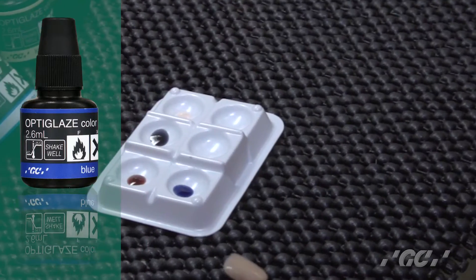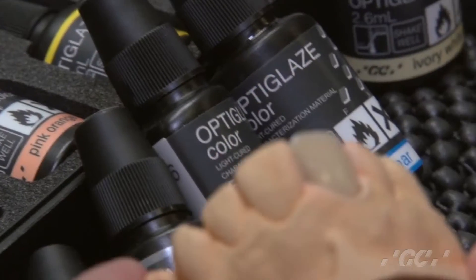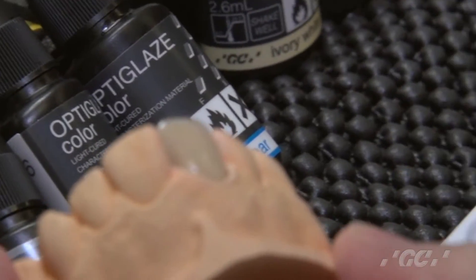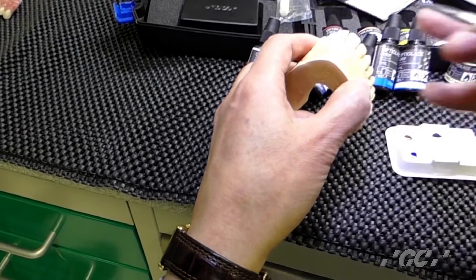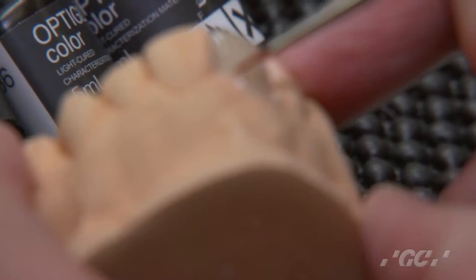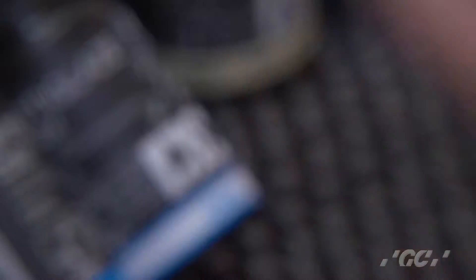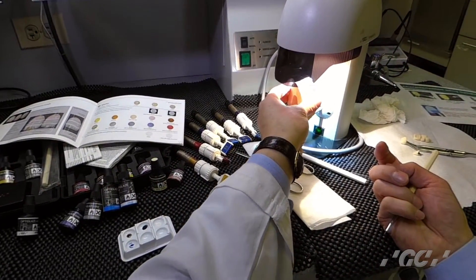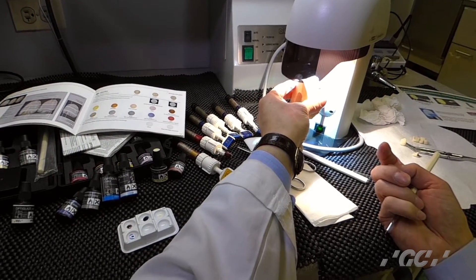Now I will do internal stains. First, if you want it a little darker here internally, this time use an A shade. Just paint it on. Do you like it? This time is just 10 seconds. Light cure it — just temporarily cure it, not completely, like a half cure.